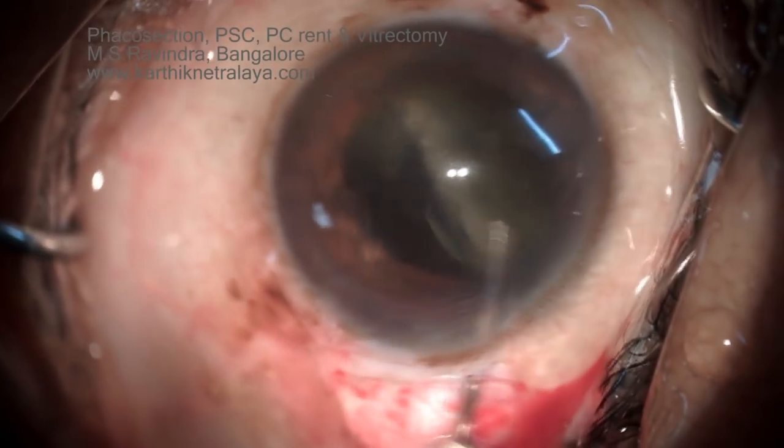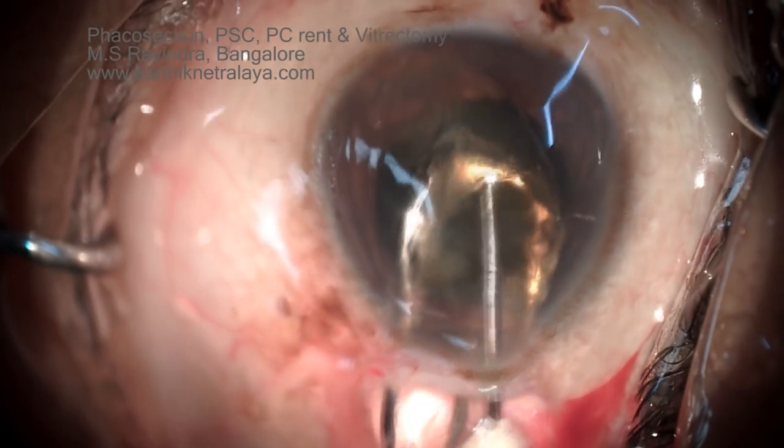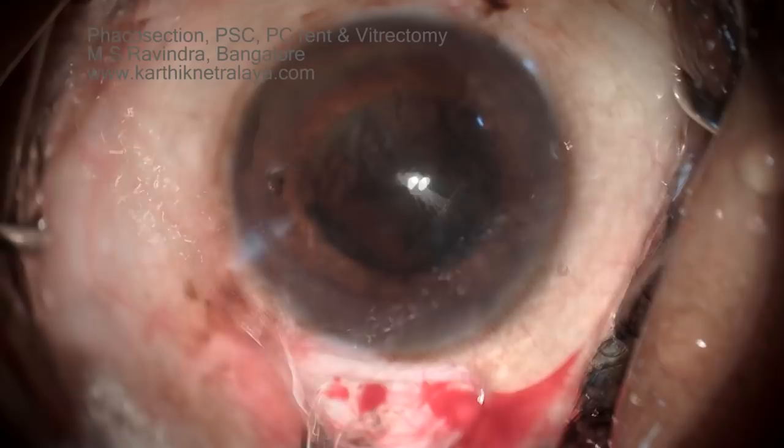The whole nucleus is now in the anterior chamber. It is being bisected and the hemi-nuclei are being removed. A little bit of epinucleus is prolapsed down by visco expression.